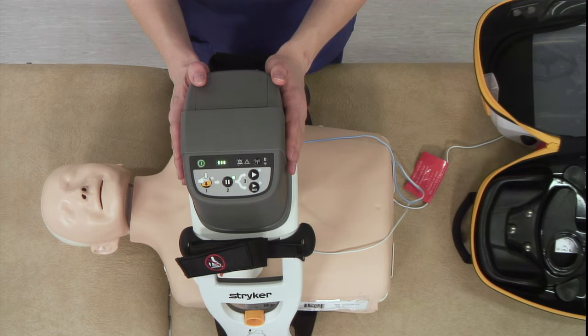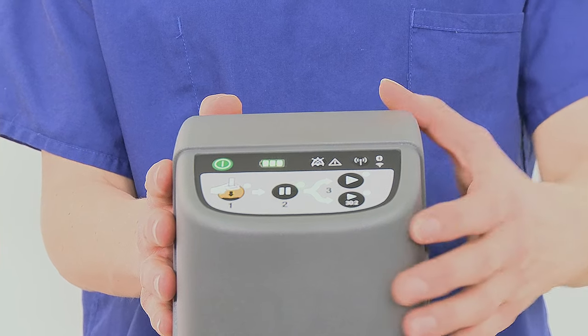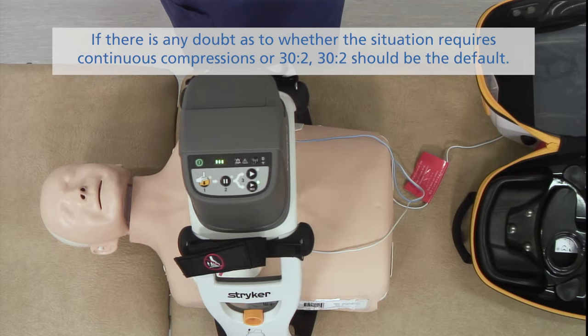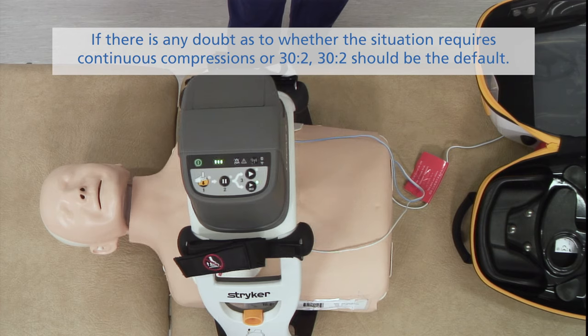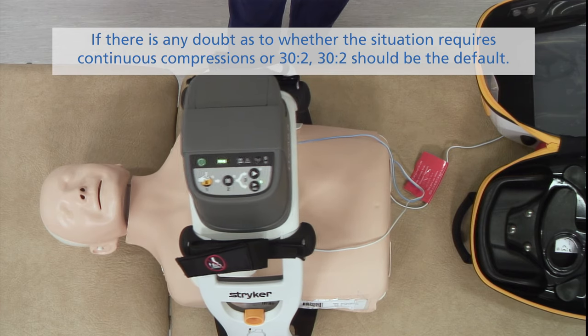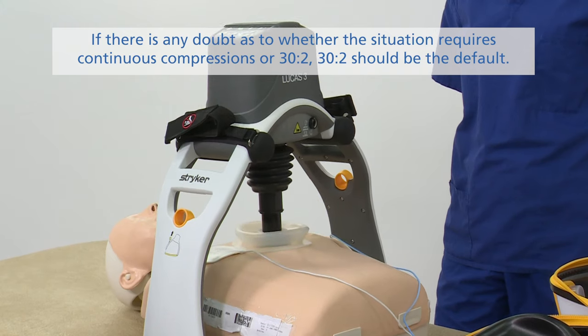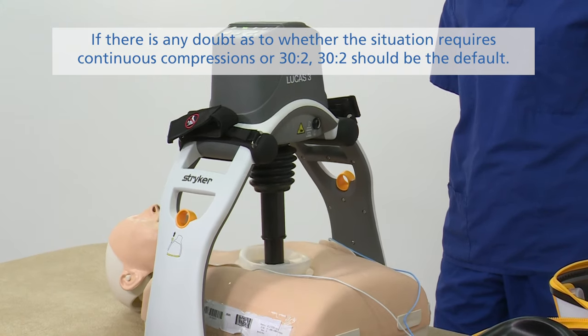Choose 30-to-2 or continuous, whichever is appropriate for your resuscitation situation. If 30-to-2 has been selected, the machine will deliver 30 compressions. Listen for the beeps to alert you when the machine is stopping for a ventilation pause.